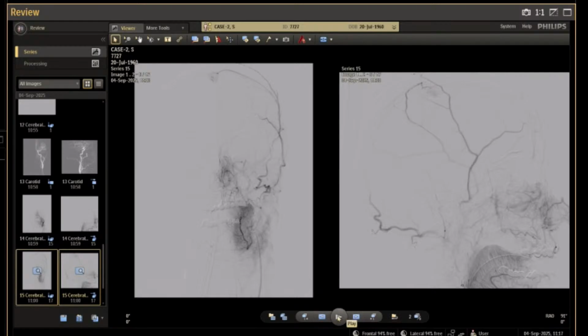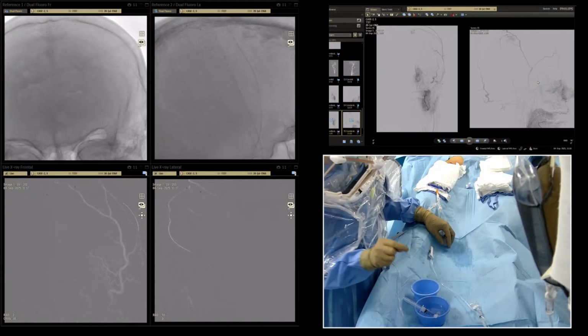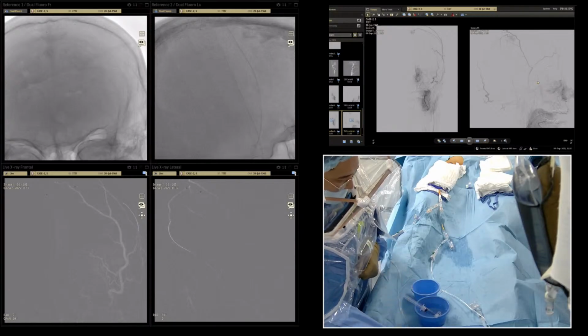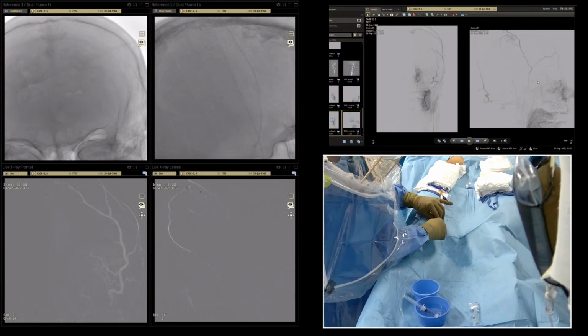Okay. Yes, it looks like we are in the correct position. Yes, if it's possible to selectively catheterize the meningioma, then why not inject something very effective? And our experience showed that endovascular treatment of the meningioma is a feasible, effective and safe treatment option.